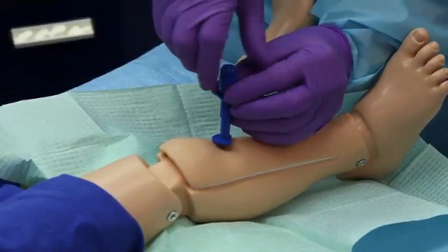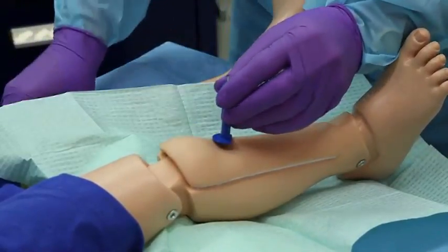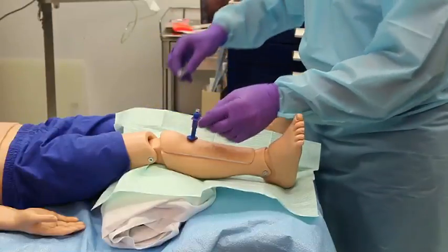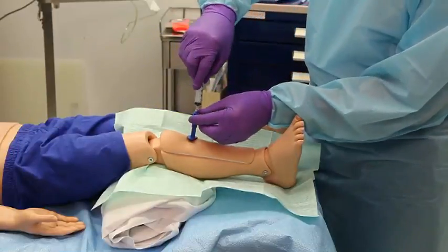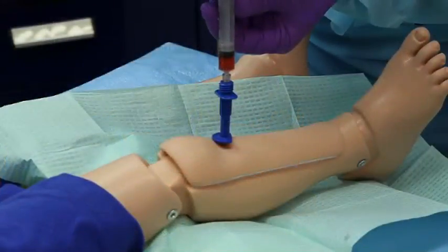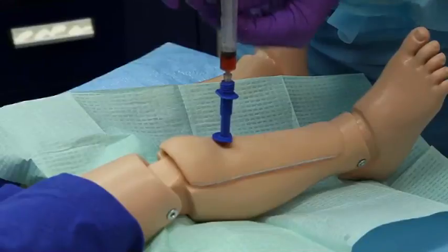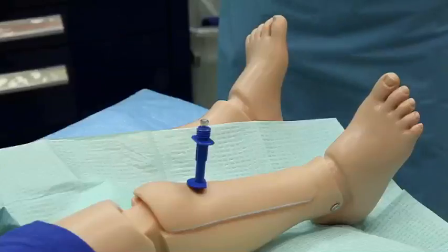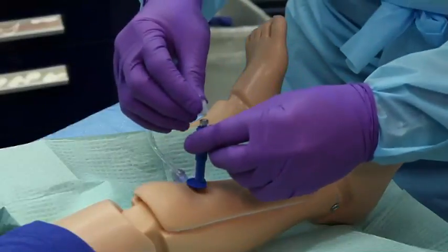Remove the stylet and attach the needle to a syringe. Aspiration of bone marrow into the syringe confirms entry into the medullary cavity. Connect the needle to large-caliber IV tubing and begin fluid infusion.